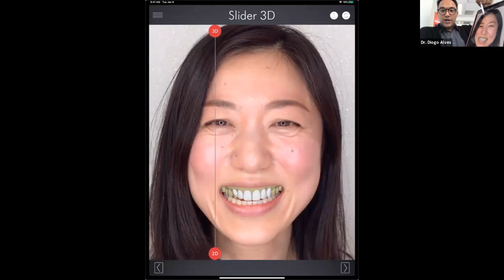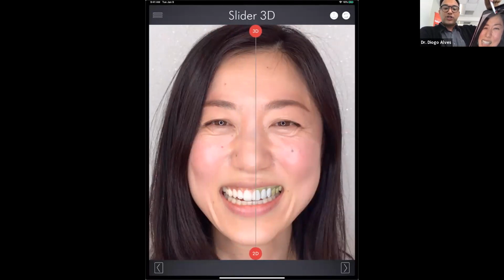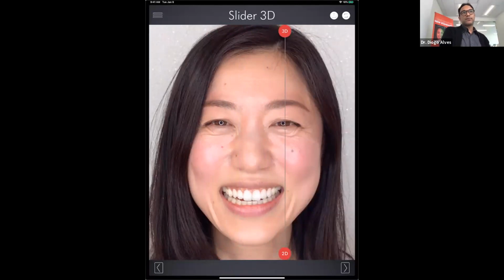What do I want to see here? I want to make sure that my 3D design looks just as planned, just the way that my patient wanted me to do. And this brings value to the ethical work. The patient will appreciate the fact that you're following what you planned before. And once you win your patient like that, your patient becomes your missionary. He starts to tell everybody about how amazing his or her doctor is.